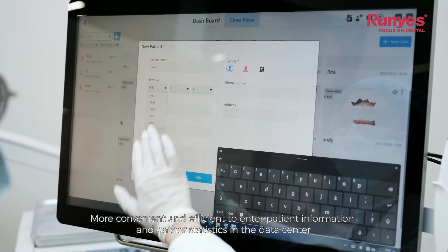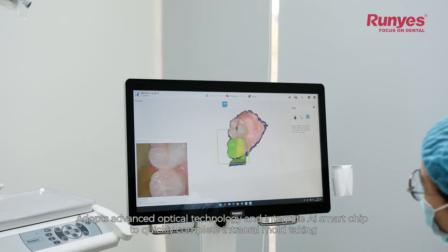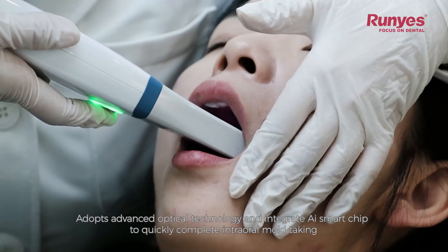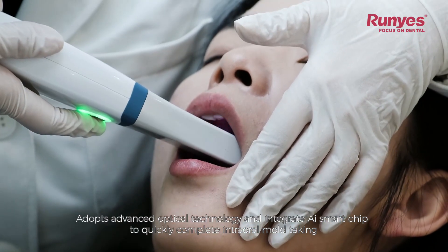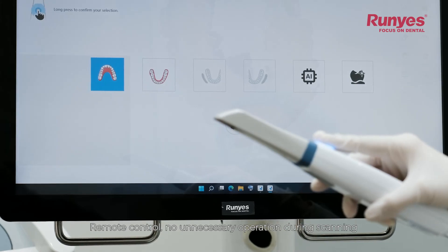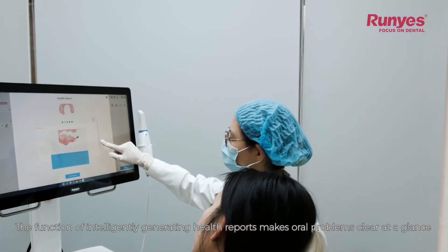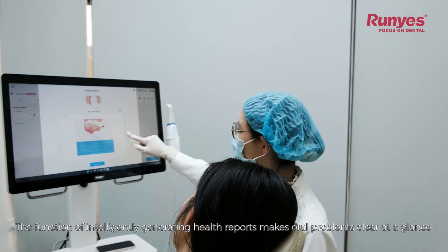It adopts advanced optical technology and integrates an AI smart chip to quickly complete intraoral mold taking. With remote control and no unnecessary operations during scanning, the function of intelligently generating health reports makes oral problems clear at a glance.